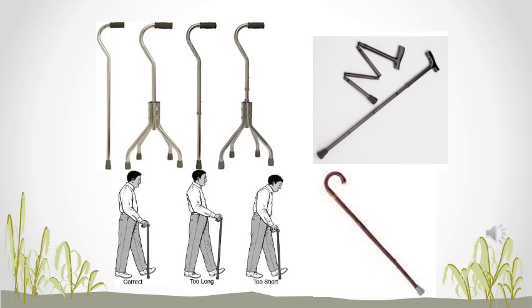And then the adjustable walking cane made out of aluminium. Can you see it? Yes, you can spot it on the top right side where it can be adjustable. And also then the cane on the top left where it's not a quadrupod, but it's also made out of aluminium.